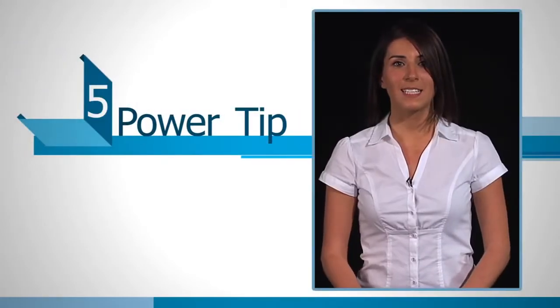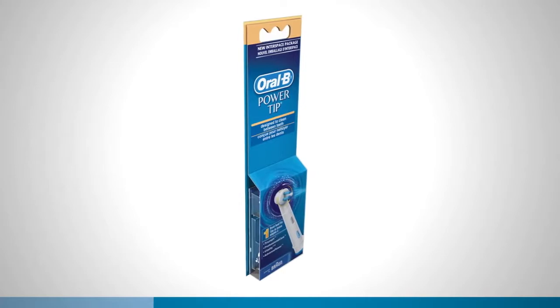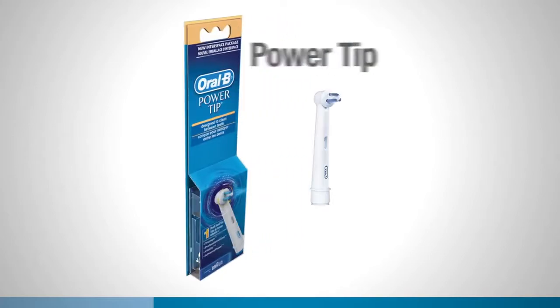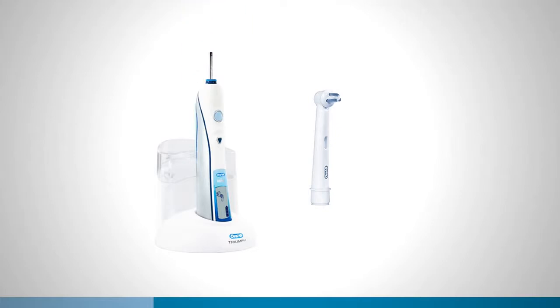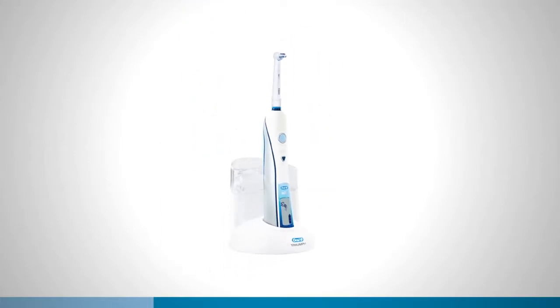When you have braces, the area directly around your brackets creates some tiny, hard-to-reach spots that regular brushing can miss. This specifically designed electric toothbrush head, called a power tip, is made to remove plaque in these areas. Make sure the power tip is attached to your Oral-B electric toothbrush as described in your manufacturer's instructions.